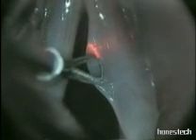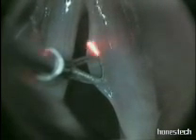A young female singer has nodules on her vocal cords. Anesthesia is by high-frequency jet ventilation. A curved beam, concave towards the left, is used for the right side. The laser settings used are 1.5 mm beam length, 1 mm penetration, and superpulsed wave in single pulse mode with a 350 mm focal length. The recommended power, software-calculated, was 10 watts with a pulse duration of 0.05 seconds.